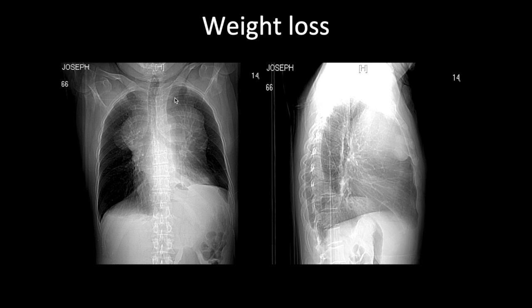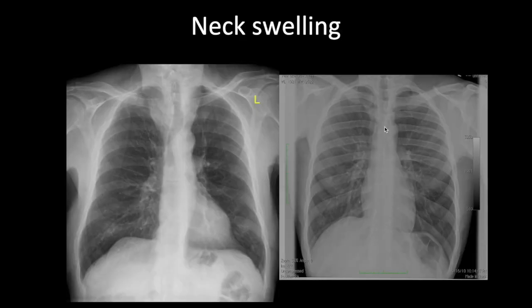Here's another example of a pretty large superior mediastinal mass, and this is a lateral x-ray showing the same pathology. Look at this one — there's widening of the superior mediastinum, but this swelling goes all the way into the neck, and the trachea is pushed by it, so it is related to the trachea. This is a goiter with intrathoracic extension. Here's a normal chest again for comparison.